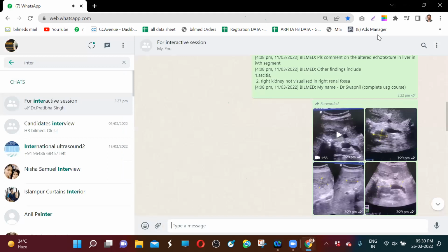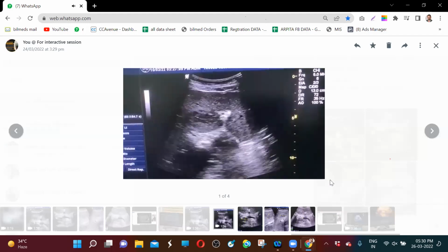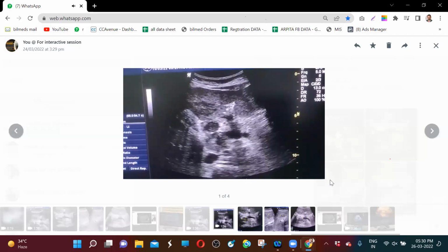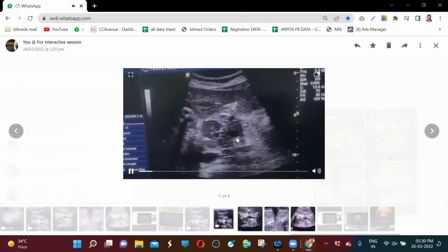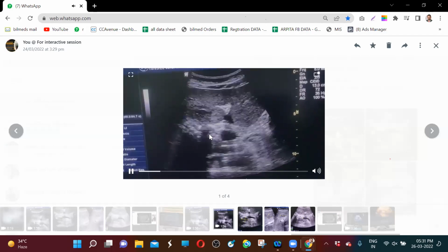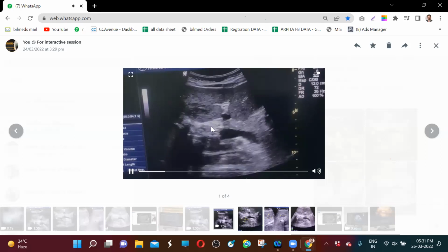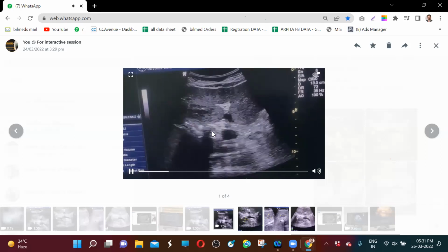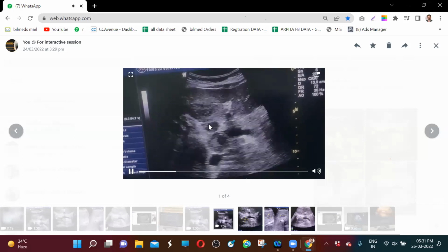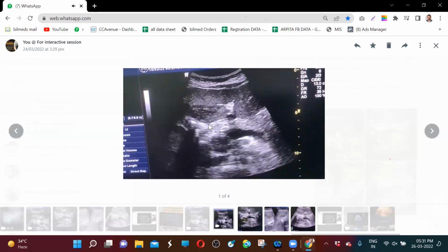Hello, sir. Good evening. What is your name? Sir, this is Dr. Swapnil. You are the person who has posted this case? Yes, sir. Very good. So now see, Dr. Swapnil, you are worried about this area over here. Am I thinking right? This one? No, sir. What I was suspecting as a lymph node, but the area of liver adjacent to the gallbladder. So that is probably where the confusion is.